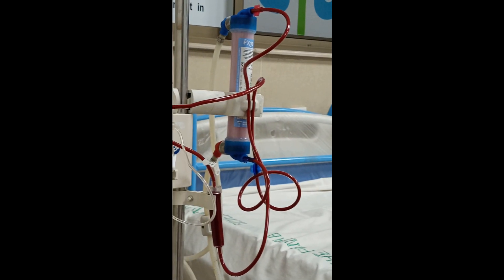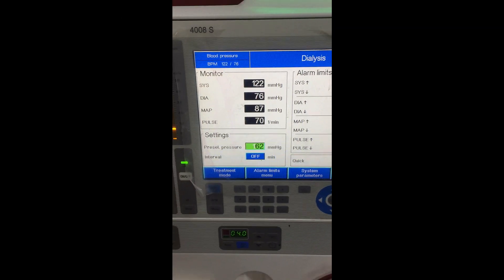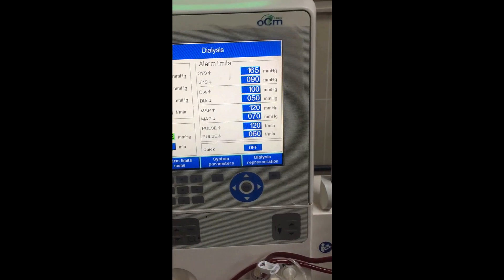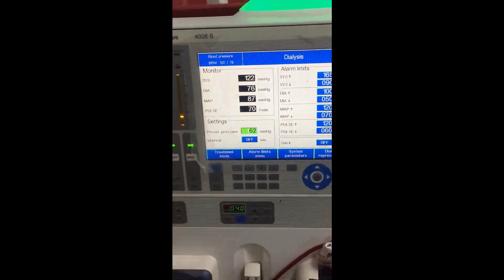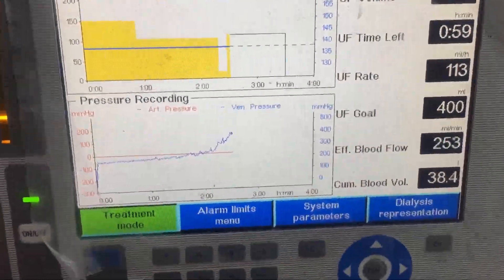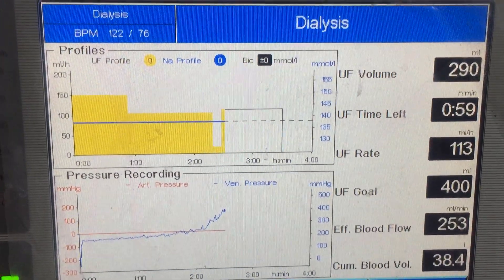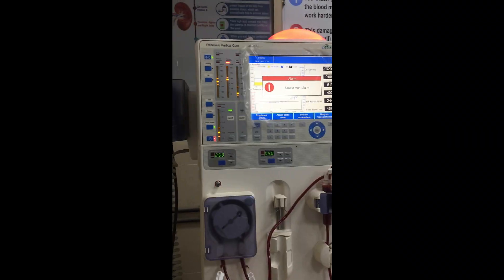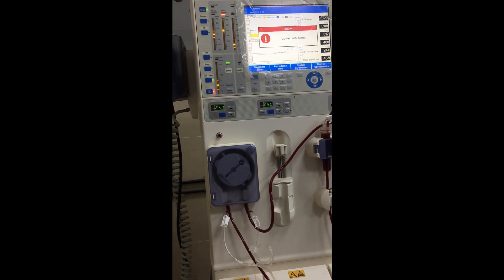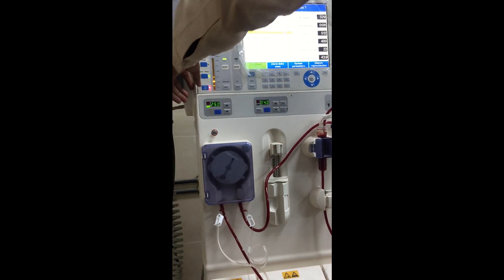This is the dialysis filter which filters the excess waste products from the blood, and we have to measure the patient's blood pressure every 30 minutes during this procedure. This is the systolic and diastolic blood pressure. These are some pressure recordings such as arterial pressure, venous pressure, the ultrafiltered volume, and the time remaining. Sometimes during the procedure the dialysis machine stops, so we have to restart the machine after every alarm.